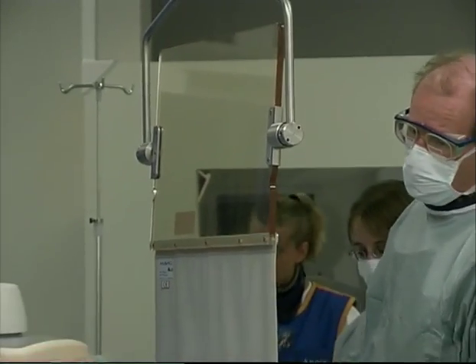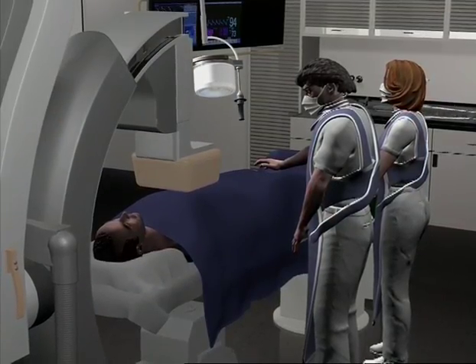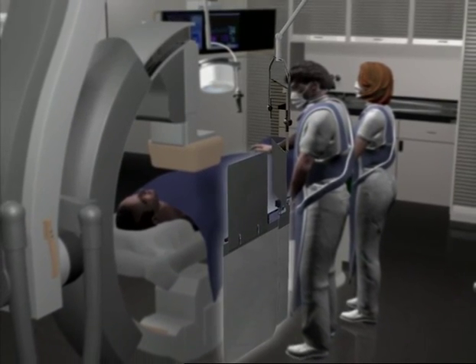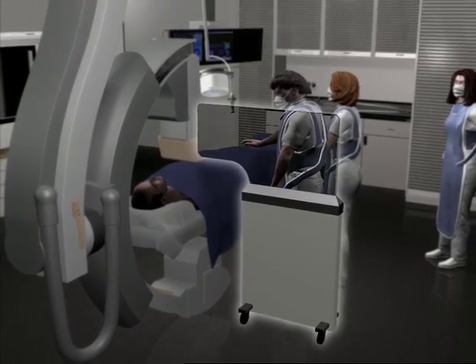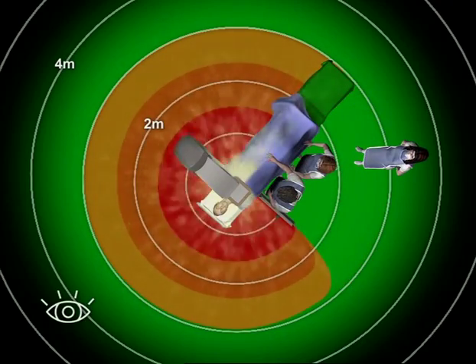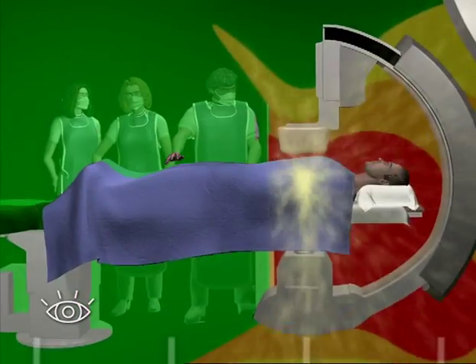Protective equipment at the examination table helps significantly to reduce radiation exposure for attending medical personnel. The following protective equipment can be used during examinations: a pivoting protective shield attached to a ceiling support, a radiation shield at the catheterization table, and a mobile radiation protective screen. The positive effect of the protective equipment on the radiation intensity applies in the basic views as well as the lateral views, in areas where the medical personnel will typically be.